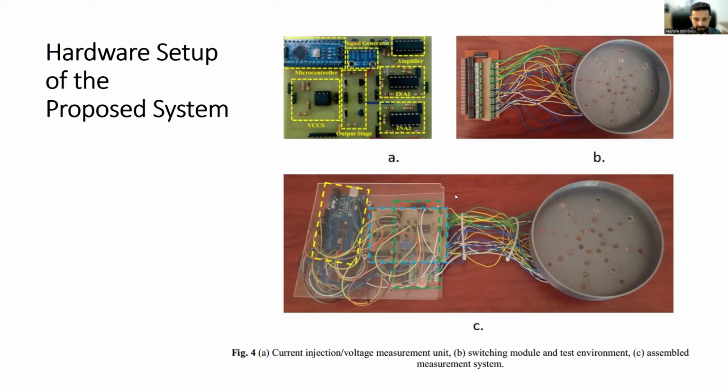The phantom tank is 15 centimeters in diameter and 3 centimeters deep, and it's filled with a saline solution at 4 grams per liter. These small copper electrodes, which are 0.5 centimeters in diameter, are embedded at the base, and a rubber marble serves as an artificial inhomogeneity. You will see that rubber marble in, I think, the following figures. It's absent here.